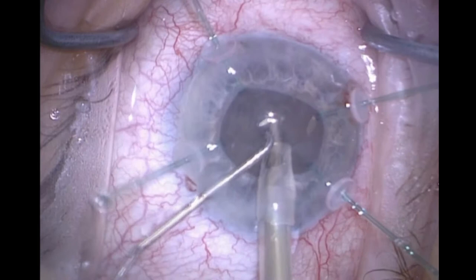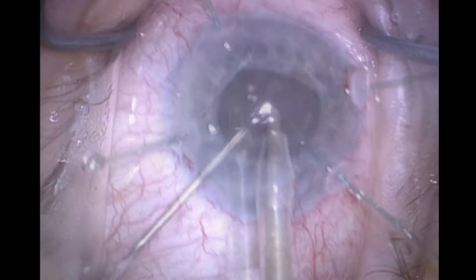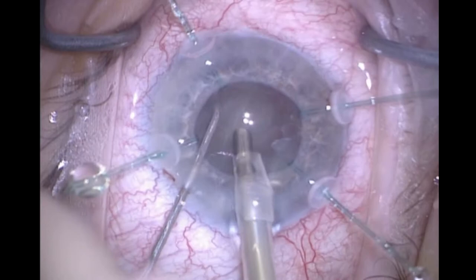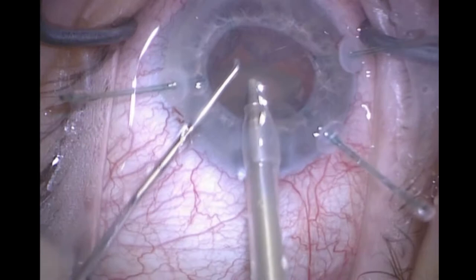The retractors are also pulling back the iris, and they're supporting the lens in the AP direction. They're also restraining the fornix of the capsule from being aspirated by the phaco tip, which might otherwise happen if the zonular peripheral tension is too weak.